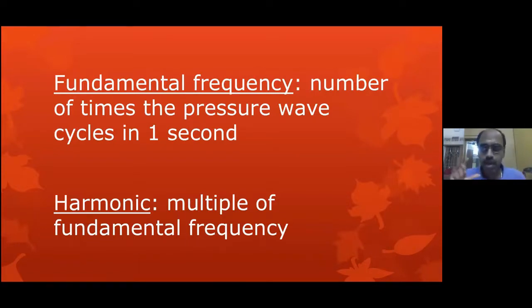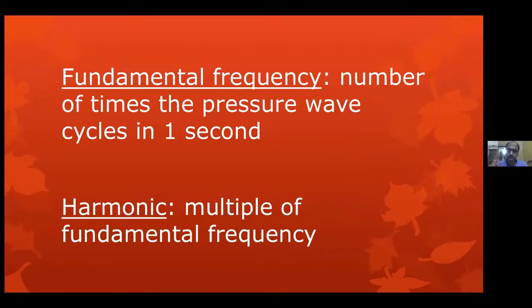For example, in a left ventricular trace, the end diastolic flick will be a high frequency deflection. In an aortic trace, the dicrotic notch will be a high frequency deflection. In a right atrial wave, the C wave flick will be a high frequency deflection. So if I am able to capture up to around 10 harmonics, I will be able to capture even the finer high frequency deflections.